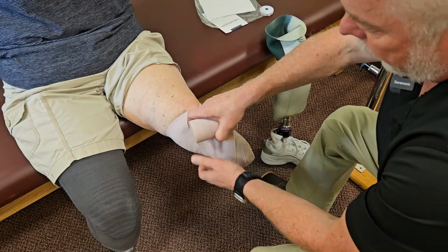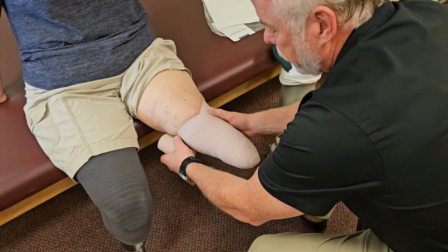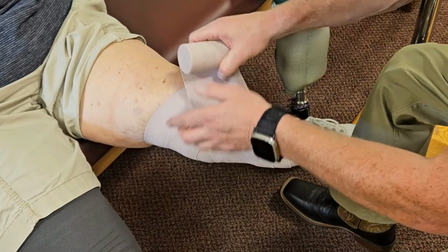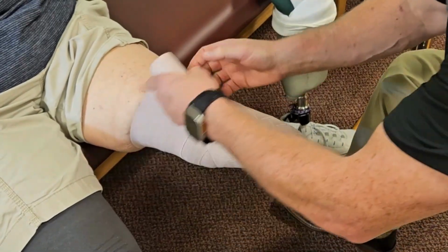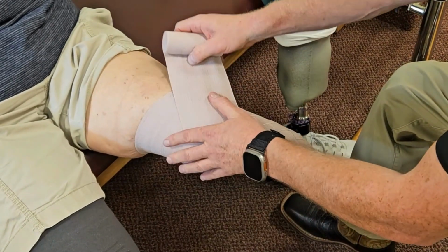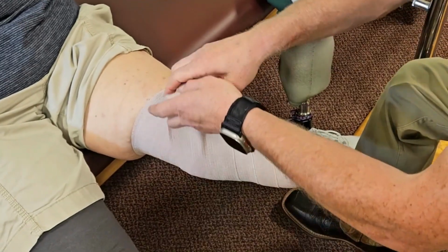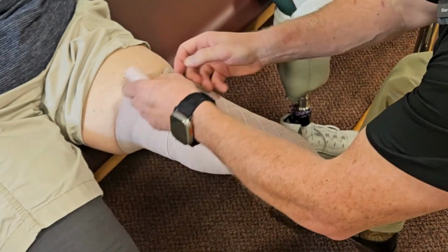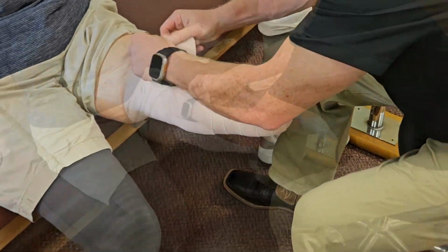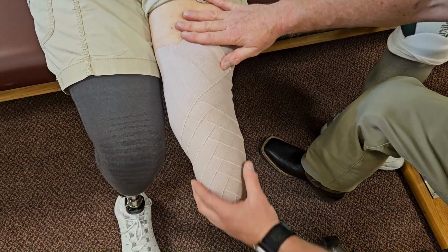You get into transfemorals, and really, for light compression, I'd rather put them in a shrinker sock and size it up, because those silicone dots on the inside help hold it on. If you try to wrap a transfemoral patient, my guess is within minutes of having it wrapped, doing bed mobility or moving around, it's going to come undone. And when they're undone, or they slide, they can cause a banding, a rubber band effect. And that's going to increase pain. It's going to block circulation. And it's really doing everything we don't want it to do. So I always recommend not even wrapping a transfemoral patient.